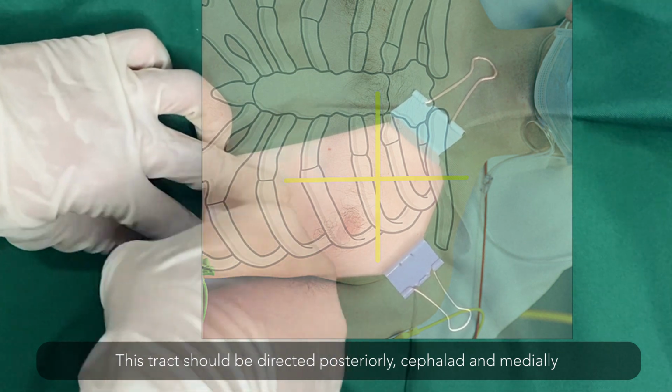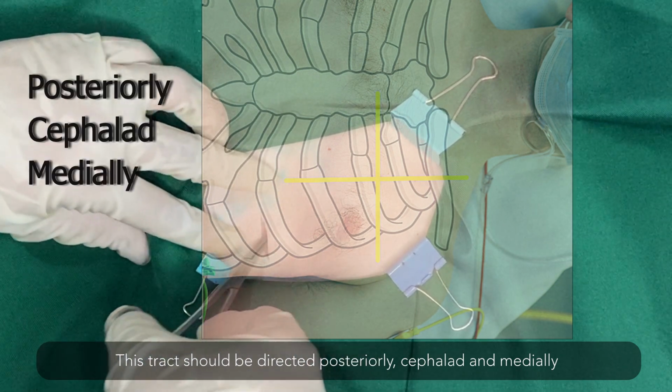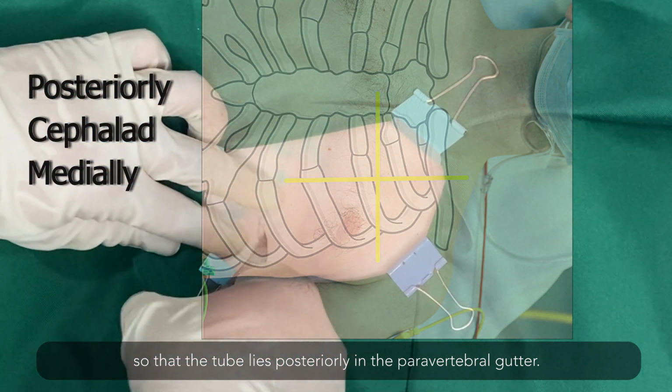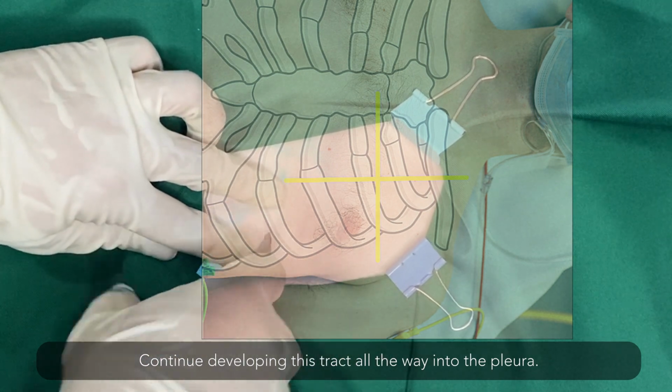This tract should be directed posteriorly, cephalad, and medially so that the tube lies posteriorly in the paravertebral gutter. Continue developing this tract all the way into the pleura.